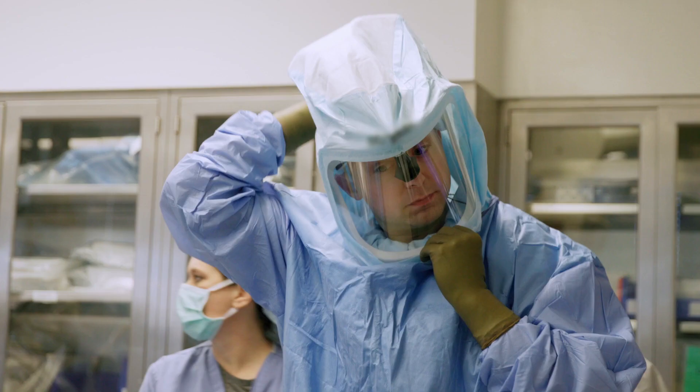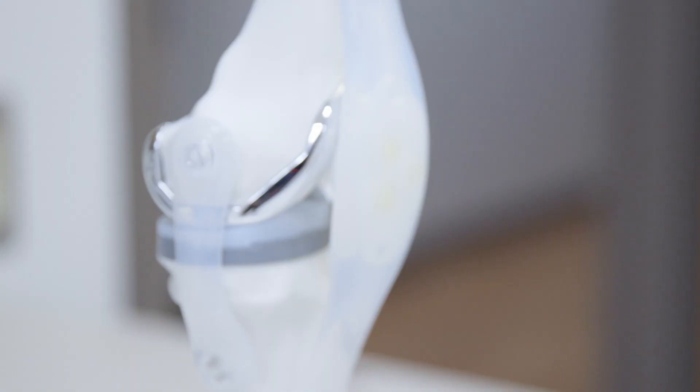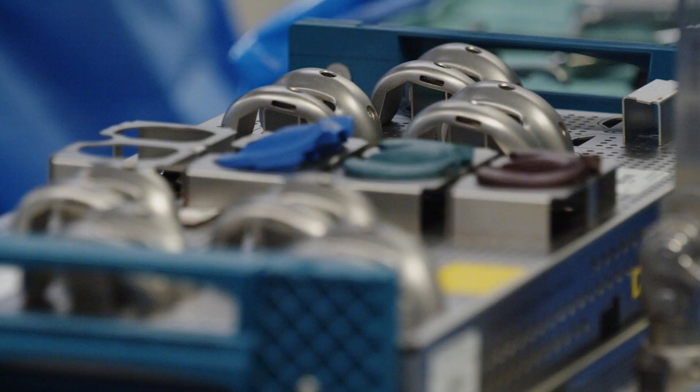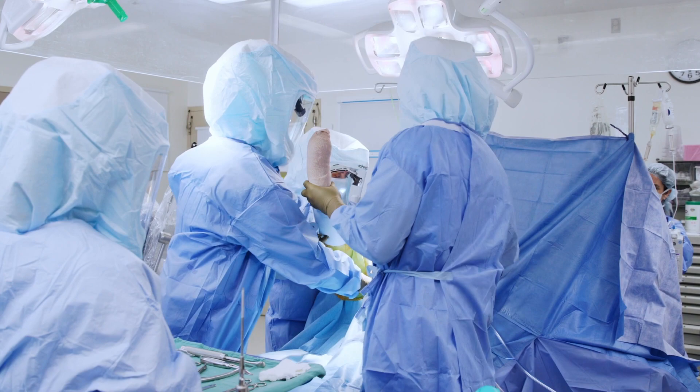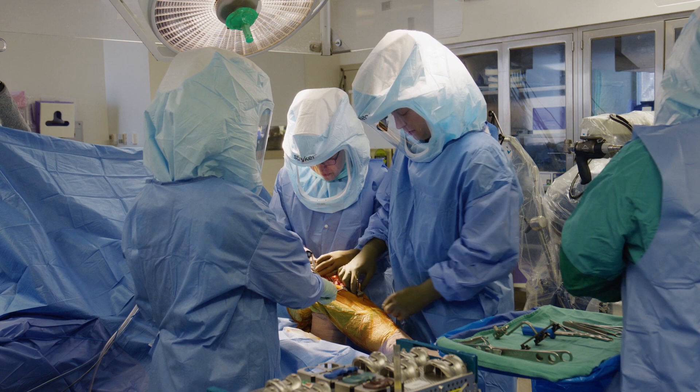I've always been interested in orthopedics from an early age. Specifically, joint replacement really appealed to me — the mechanical nature of the joint and just the ability to really improve a patient's quality of life. What drew me to robotics is that it really is the next frontier of joint replacement. In the last five to ten years, it's really taken off. We're still using the same implants, the same techniques and ideas, just a more precise tool that allows us to be more accurate and really customize the placement of the implants to the patient's anatomy.